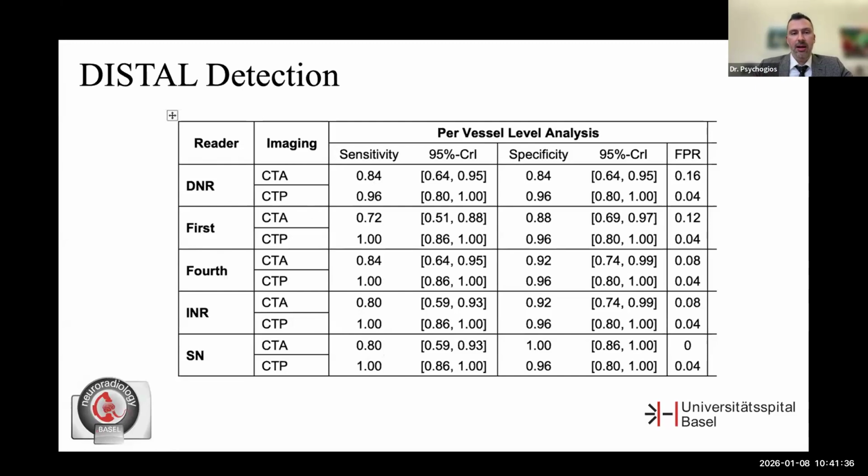We tried to do this trial also with timing that's restrictive in the emergency setting. So we tried to replicate what you usually have as a first-year resident at night, where your neurologist wants an answer within 2 minutes. And again, I think this is really important to consider, that you don't have the whole time in the world at night to analyze the CTA and find the occlusion.